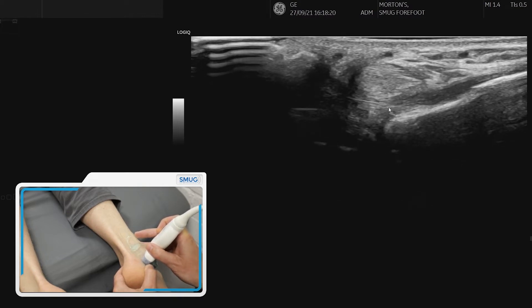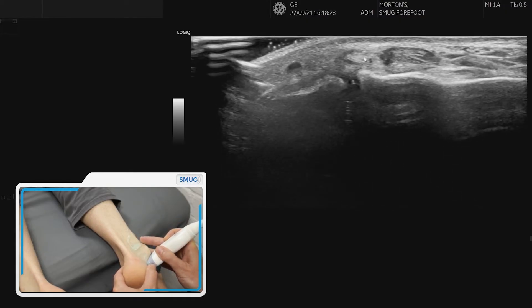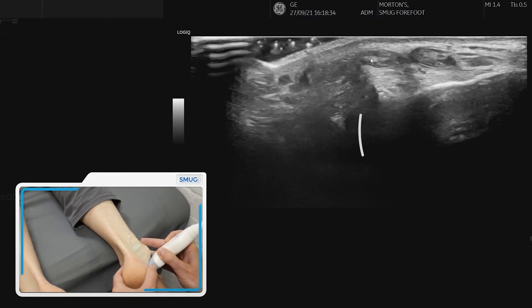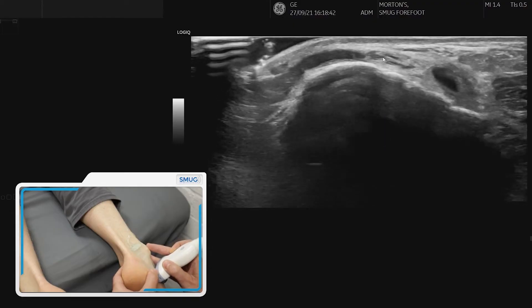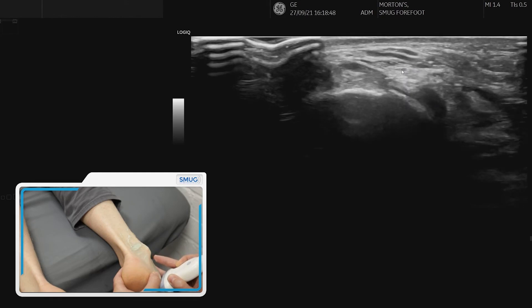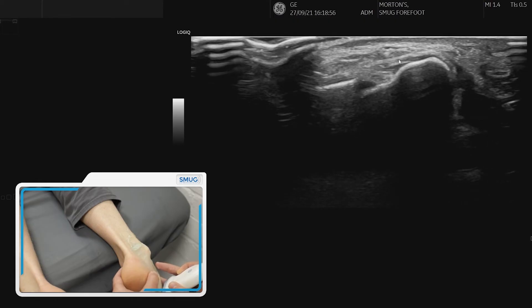We can follow it a bit further down — that's the subtalar joint underneath, so look for any fluid there. As we come down you can see the brevis and longus separate. Following the tendons down, peroneus longus goes underneath the foot and you can follow peroneus brevis all the way onto the fifth metatarsal — in transverse section looking for tendinopathic change, and also in long section where it attaches onto the fifth metatarsal.